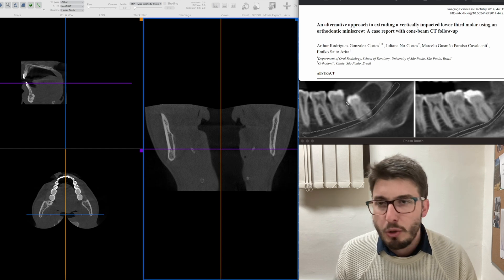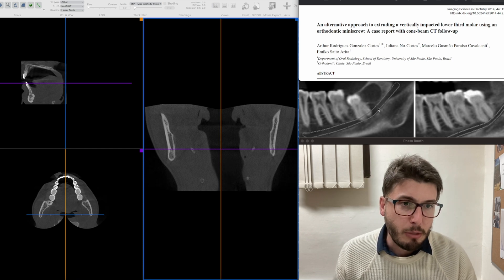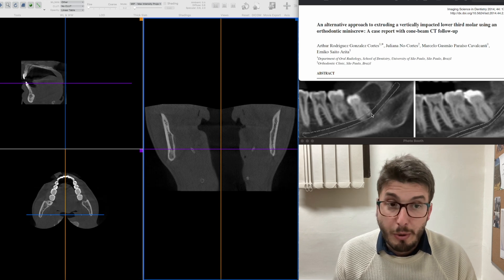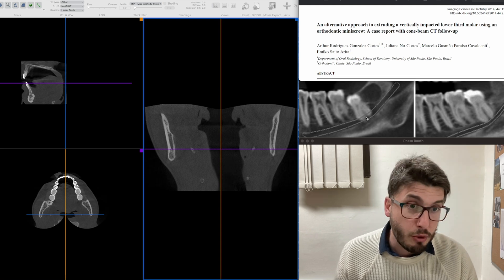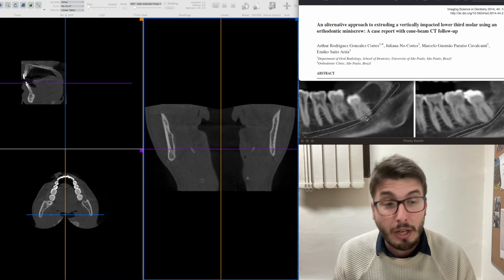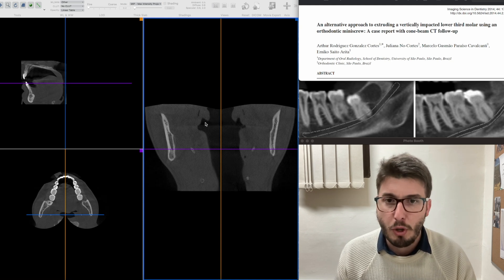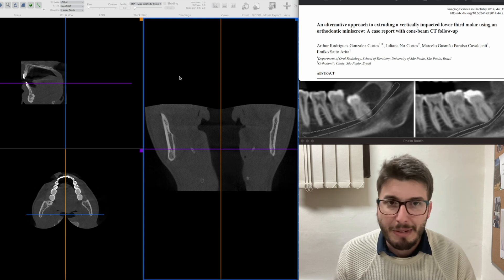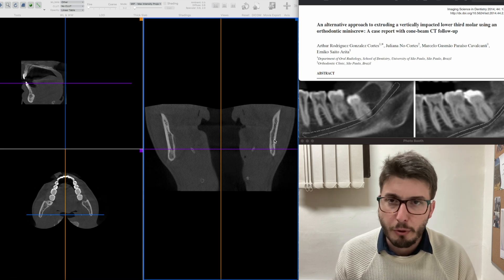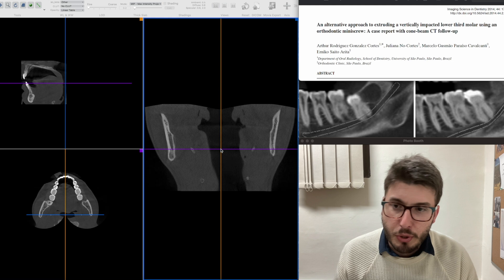There was also distal bone loss of the second molar, confirming extraction was needed. Another complication was the location of the mandibular canal in relation to the roots — we couldn't tell whether the canal was buccal, lingual, or passing between the roots. To diagnose this we need a DICOM viewer, such as the Horus software I use in my videos, which is the Horus Project software for macOS.